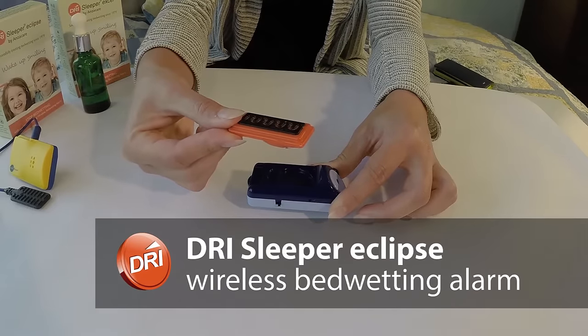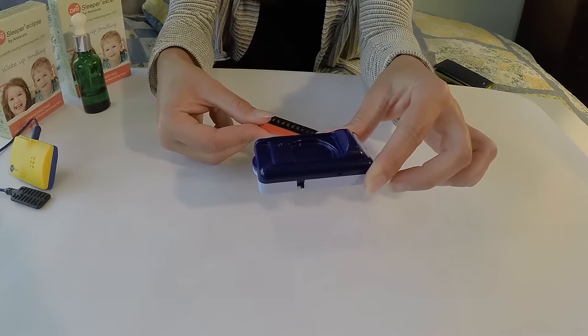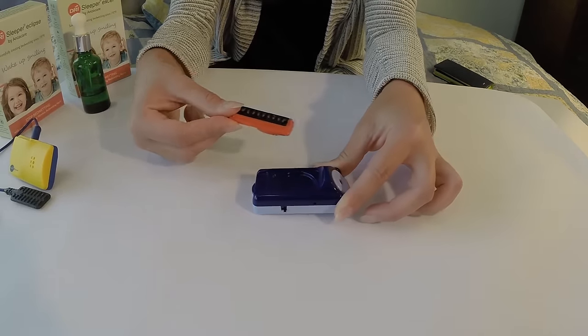The Eclipse wireless alarm has two parts: a sensor which goes inside the underwear, and a small alarm which can be placed on the bedside furniture.